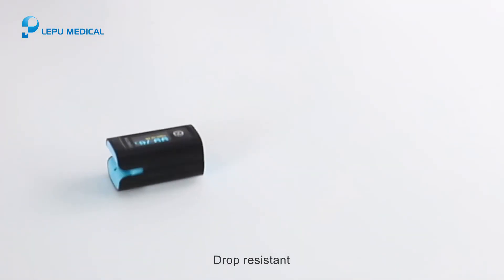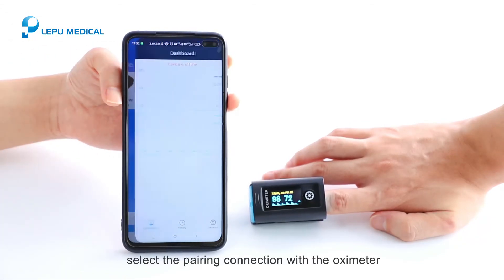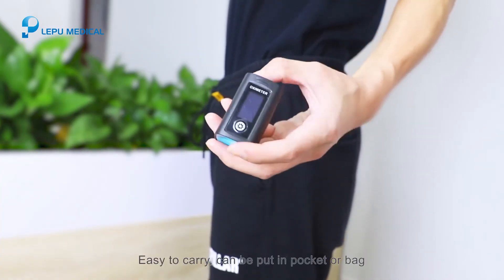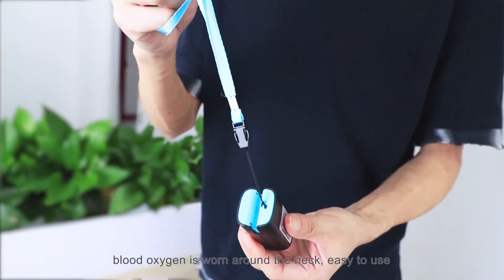The device is waterproof and drop-resistant. Turn on your phone's Bluetooth, open the app, and select the pairing connection with the oximeter to view real-time monitoring data. It is easy to carry and can be put in a pocket or bag. It comes with a rope so the oximeter can be worn around the neck.